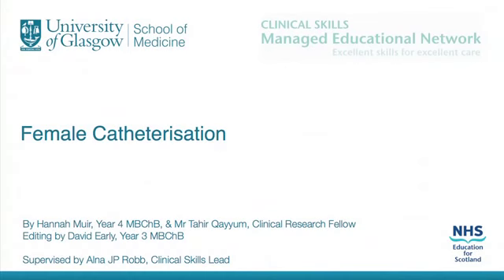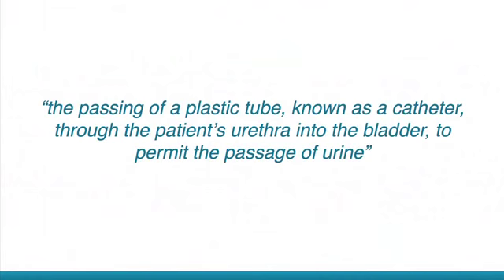Welcome to the Clinical Skills Podcast for Female Catheterization. This podcast will cover the procedure for the insertion of a female urinary catheter using a Foley catheter only. Urinary catheterization is the passing of a plastic tube known as a catheter through the patient's urethra into the bladder to permit the passage of urine.